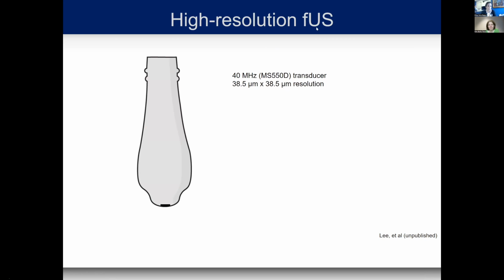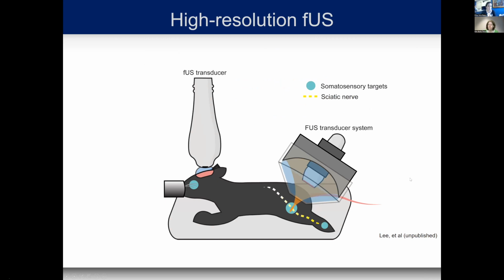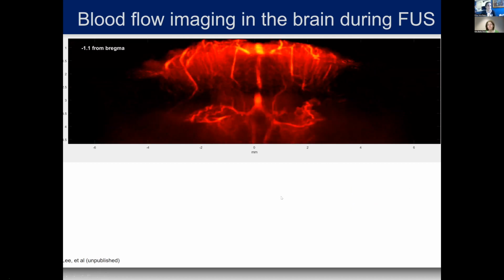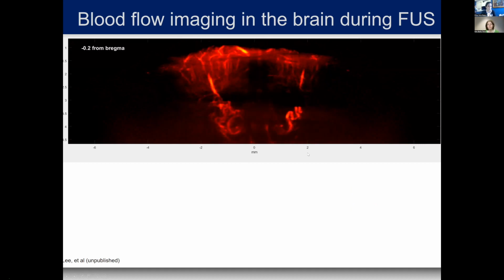And we also use functional ultrasound that I introduced earlier. In this case, we use a higher frequency for imaging, 40 megahertz, and we have even better resolution than what I showed you in the CNS modulation. We image the mouse after craniotomy with thousands of frames a second, and we're getting a cerebral blood volume image at the same time as we are modulating the nerve. This is work done by Stephen Lee, who graduated last year in my group, and you can see now a three-dimensional raster scanning of the entire mouse brain, the cortex and the subcortical regions.